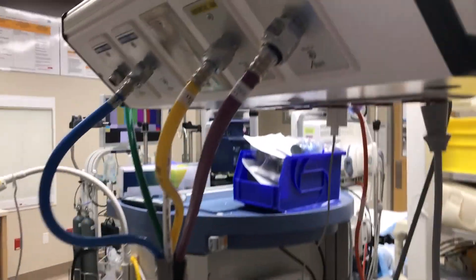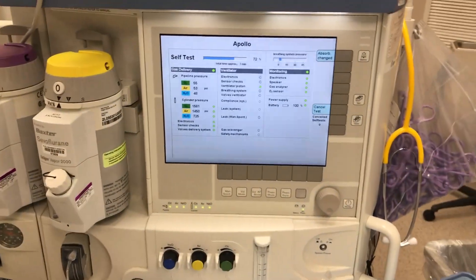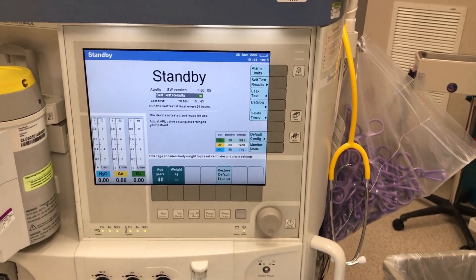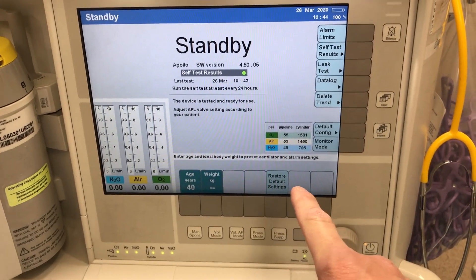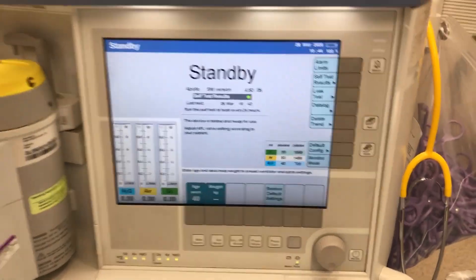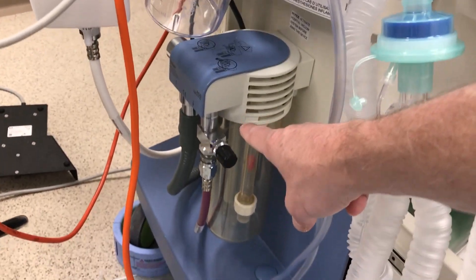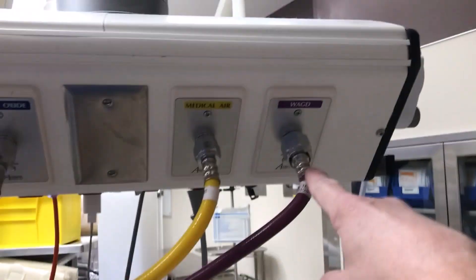We come back to the front — the machine is continuing to run the test, now at 72%. Once the machine runs the tests and passes, it will display self-test results and then the machine is ready to work. They recommend running the self-test at least every 24 hours. I made a small correction: on this particular machine, the scavenger system for excess gases actually goes to the purple tube, which connects via suction to the waste anesthetic gas line — that is the purple line.